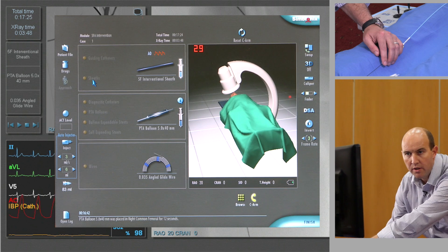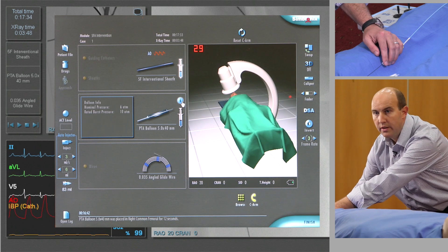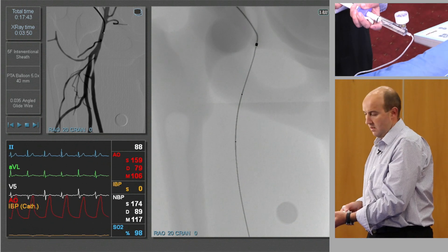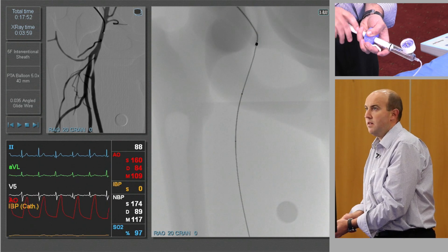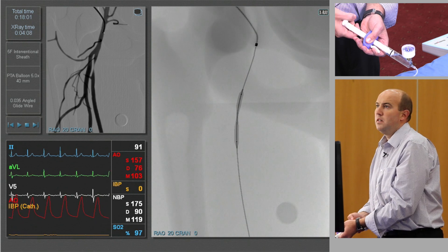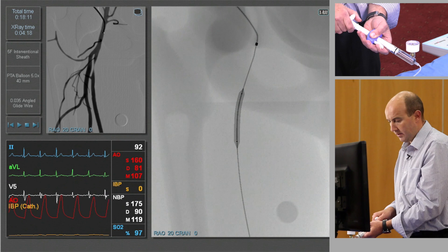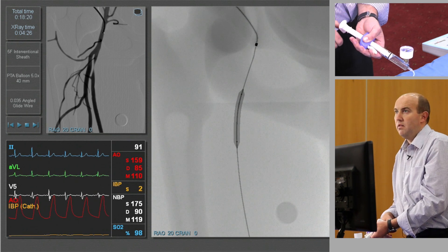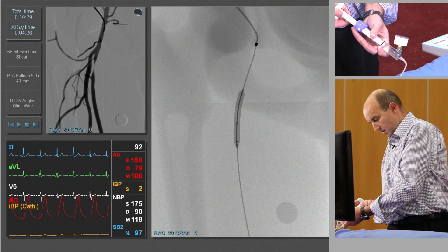Just to double-check the pressures on the angioplasty balloon — click on the information bubble, and that tells you the nominal pressure is six atmospheres and the burst pressure is 10 atmospheres. Go to your inflation device and screen without the mask. Here it goes — you can see some waisting on the balloon. I'm at two atmospheres, and that's just beginning to get up to nominal size. We're up to six atmospheres now, and I'll leave it at about eight. In reality I'd leave this up for probably 30 seconds.